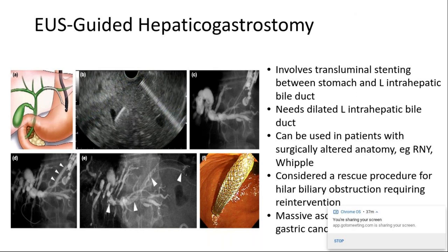Intrahepatic access is the only choice in patients who have a proximal or hilar biliary obstruction and is usually more convenient in patients with a distal gastrectomy, since imaging the CBD under EUS is not always possible in these patients with altered anatomy. One advantage of transmural drainage after intrahepatic bile duct access over transpapillary drainage is that the challenging step of antegrade guide wire passage, which is required for both rendezvous and antegrade stenting, is avoided. In addition to guide wire passage, rendezvous also requires an accessible papilla, which is usually not the case in patients with surgically altered anatomy or a tight duodenal stenosis. Next slide.